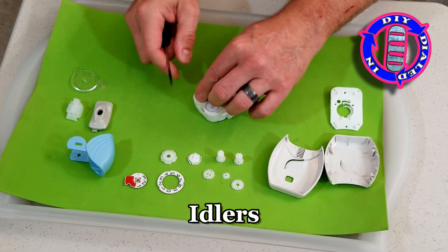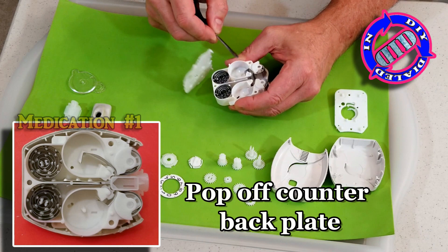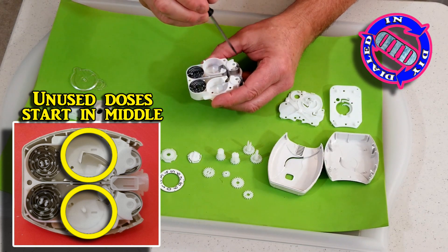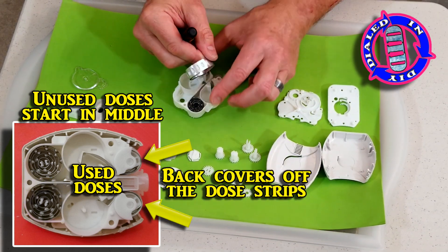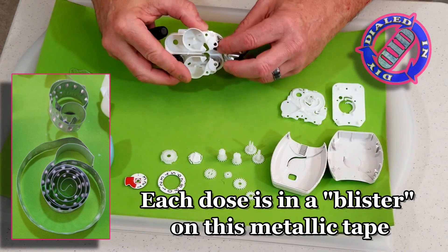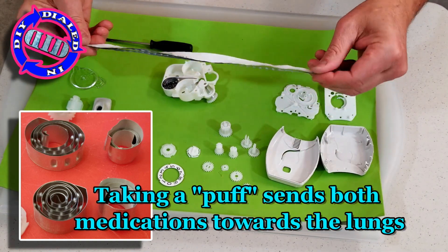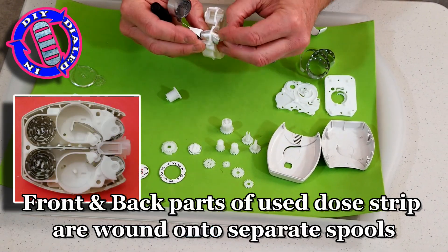As soon as we get down one more layer we're going to get to the heart of this drug delivery device. As you can see, there are two spools of blister packs at the bottom — each one holds a different medication. What you're seeing here is the finished tapes after all the medication has been used. The unused med starts in the middle on two complete spools. When used, the blisters go to the bottom and the tape that was covering the blister pack gets moved to a separate spool at the top. The really clever thing about this design is it allows two completely different medications to be stored separately in a sterile place. By simply advancing this forward you open up one of each of the medications, and taking a puff delivers both at the exact same time, precisely where they need to go.